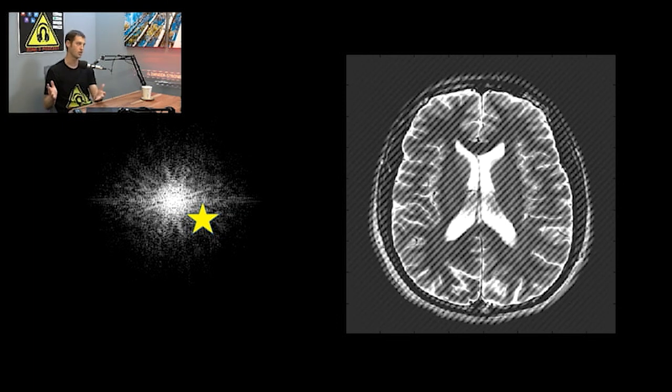Right. Yeah, okay, my mouse is working. So if you draw a line, here's the corduroy pants in Kspace, and then that line is like 90 degrees versus whatever's going on in the image space. I got it. I got imagery in my head now. So as it goes further from the origin, that means higher and higher frequencies, and then the direction is determined by this line. And again, this is a real artifact you can encounter once in a while.